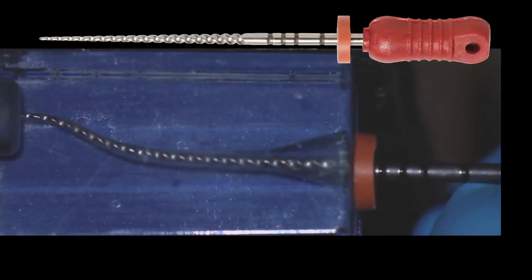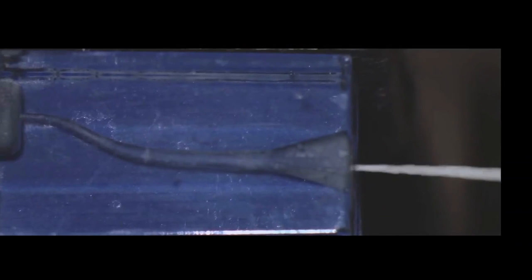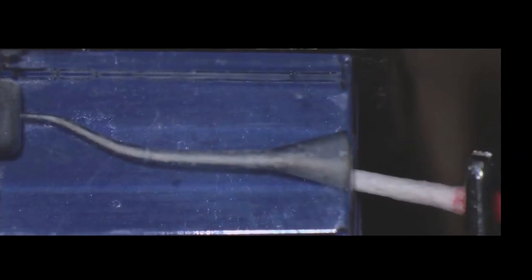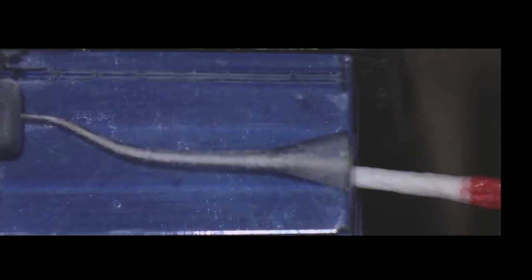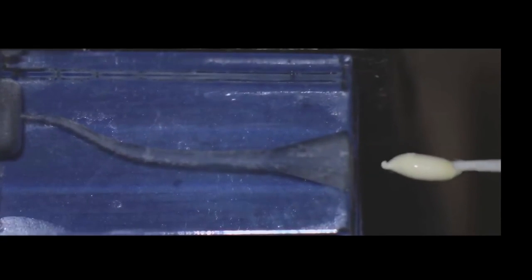Now we are verifying with a size verifier that we have sufficient space in the canal to receive our core material for obturation. We dry the canals very well. After drying the canals very well, we need to place some cement. And we place the cement at the entrance of the canal.